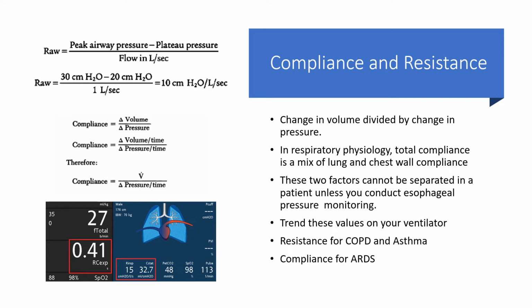So understand how to use compliance and resistance and what kind of conditions it matters to. Most ventilators have it, as in the picture on the lower left. They show resistance and compliance right there on the screen.